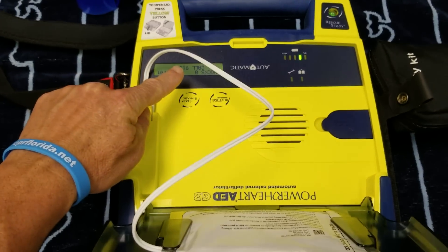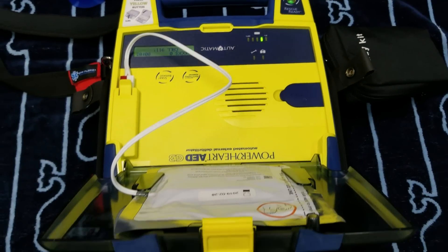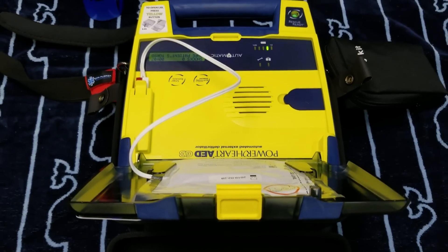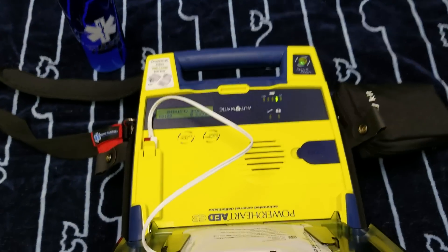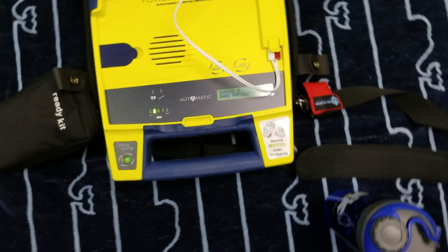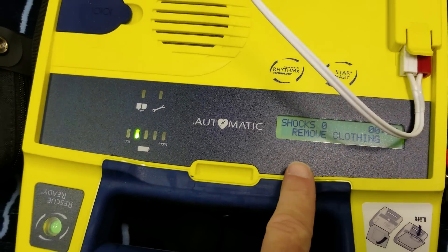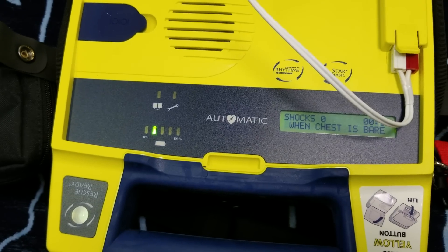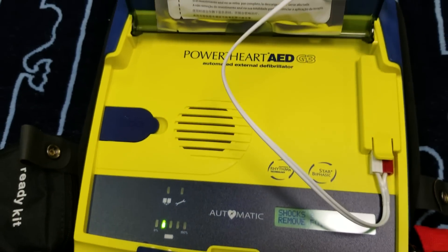The screen says: 'Stay calm, follow these voice instructions.' It's actually pretty loud. It then says: 'Make sure 911 is called now.' The louder AEDs then instruct: 'Begin by exposing patient's bare chest and torso, remove or cut clothing if needed.' The screen also prompts you when the patient's chest is exposed to remove the square foil package from the lid of the AED.